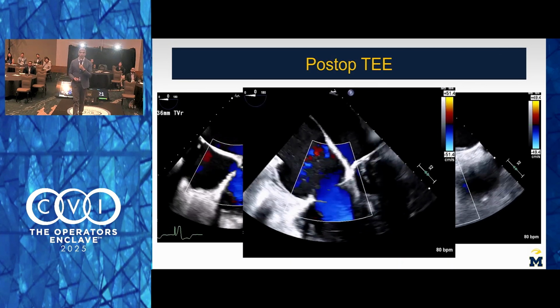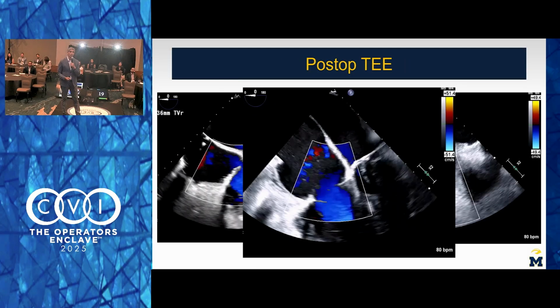Really had quite trace TR. I'm not sure if somebody can play that or not, but trace TR.